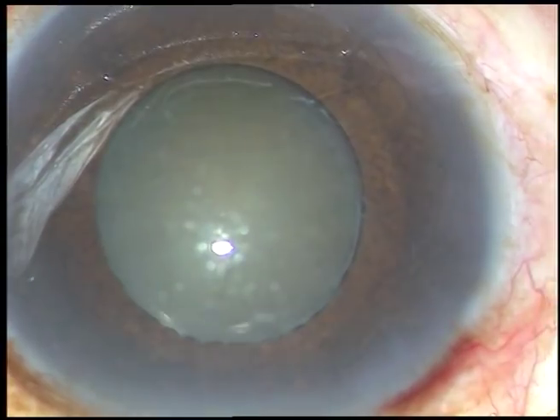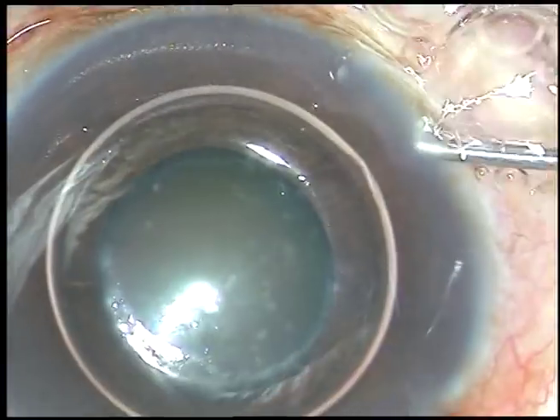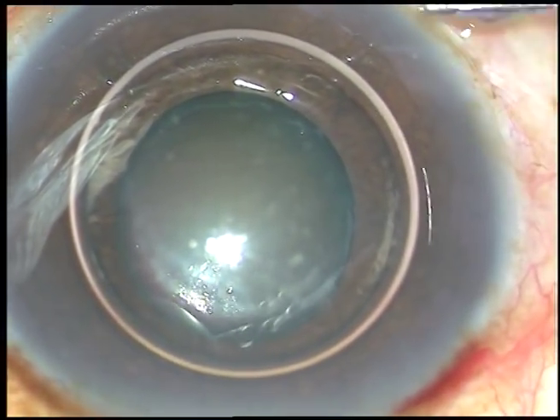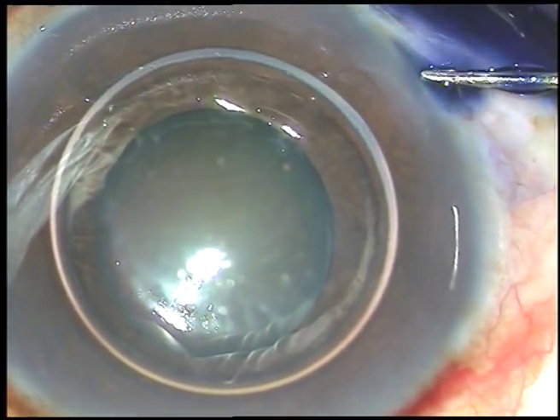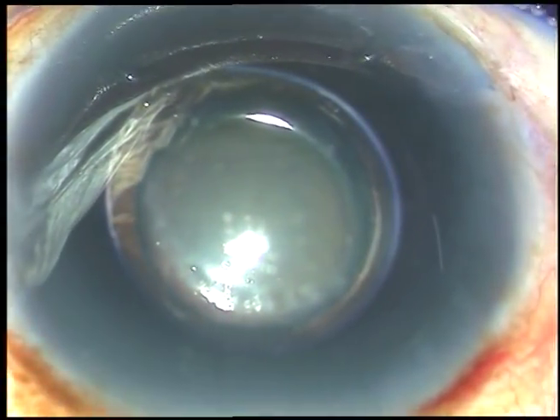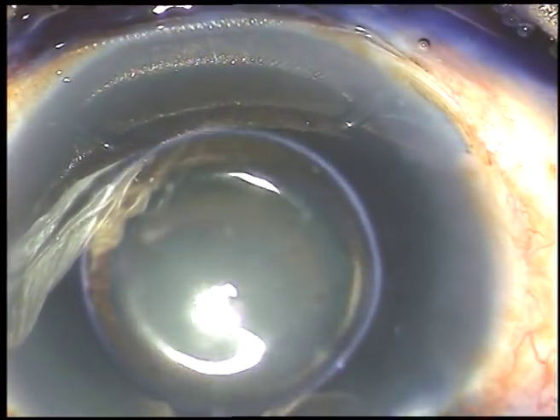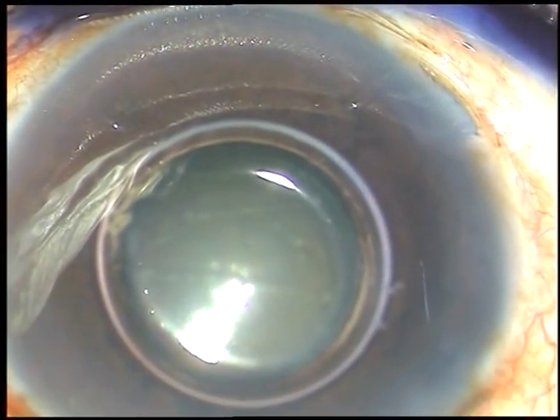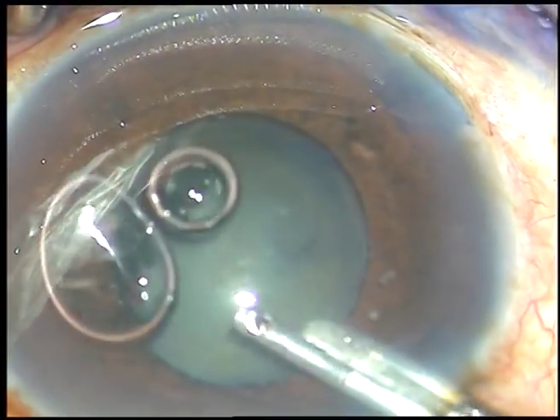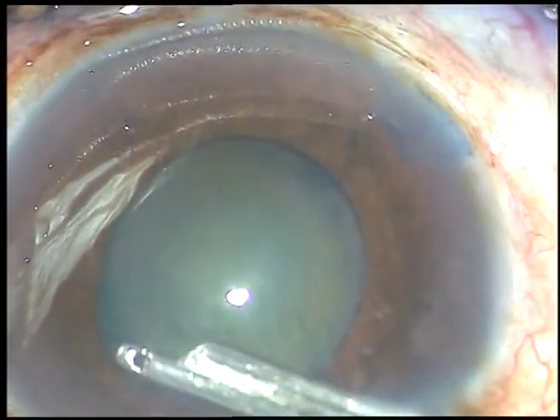Now I am going to stain the anterior capsule with trypan blue dye. First I inject an air bubble, and beneath this air bubble, here goes the trypan blue dye. The dye is spread evenly over the anterior capsule. A little bit of adrenaline has been injected but it didn't have any effect in this case. Now the dye is washed out.